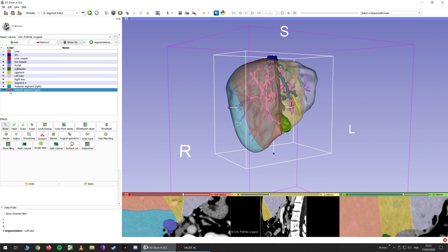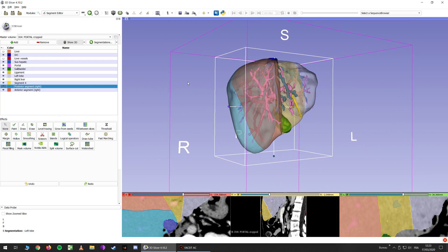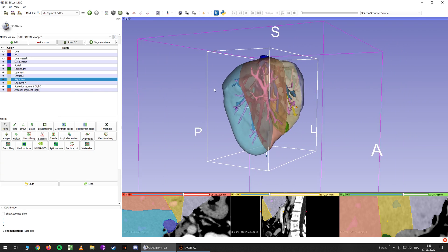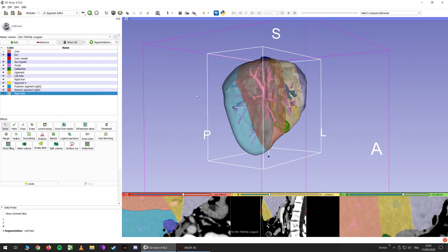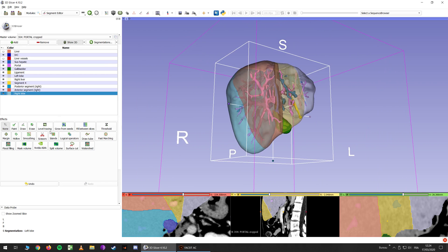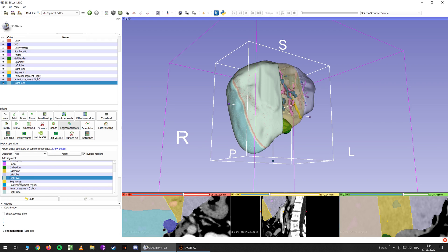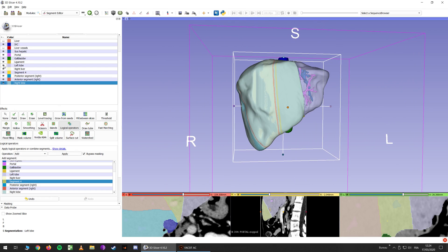Now let's talk about volumetry. I will delete segment 5 and keep the rest. If you want to perform, for example, a right hepatectomy, you will see the volume of the right liver. If you want to perform a right lobectomy, you will need the right liver and segment 4. So you go to logical operators, click add, add right liver and segment 4 — now you have your right lobe.